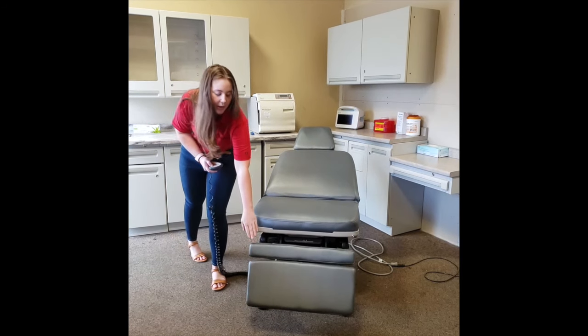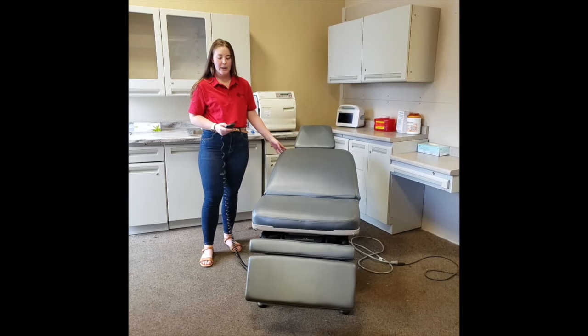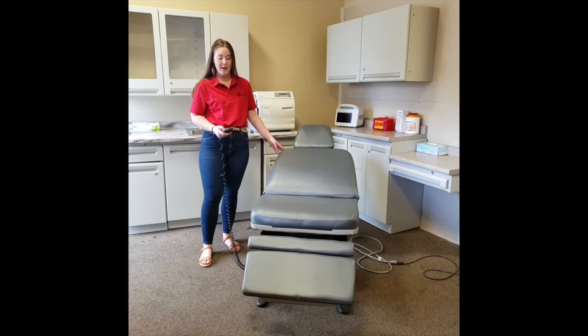On our footrest down here, we have our last function on the top that will bring it up, as well as down.